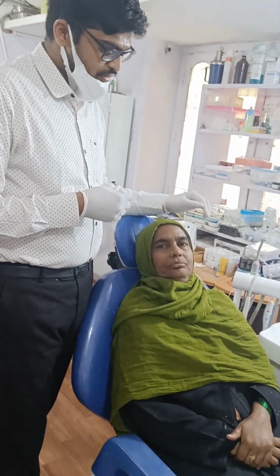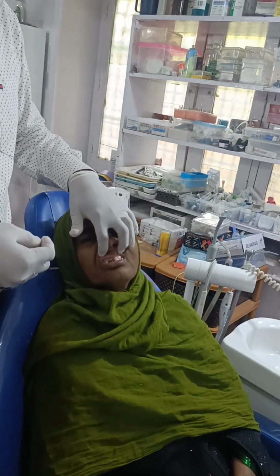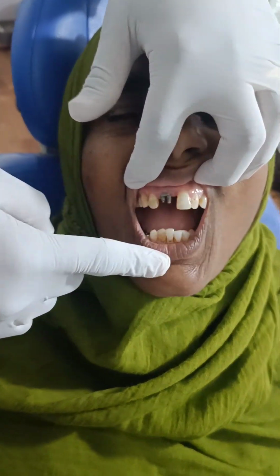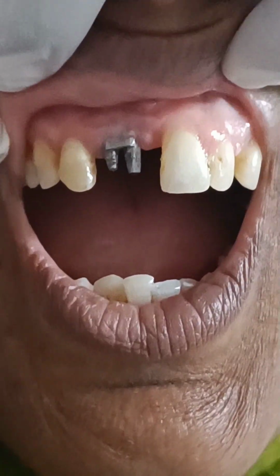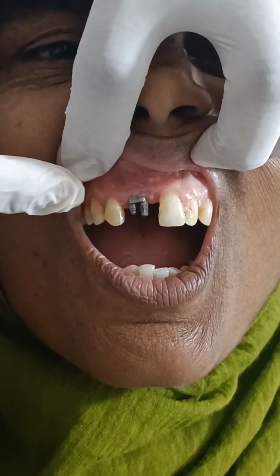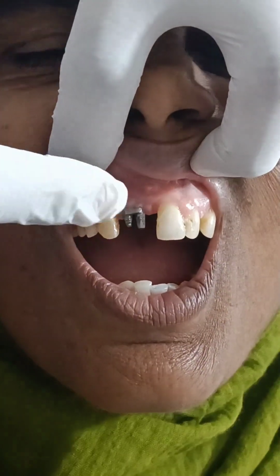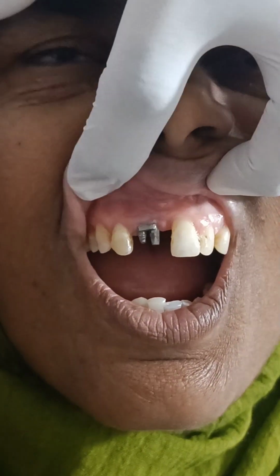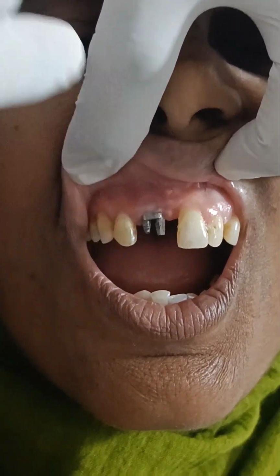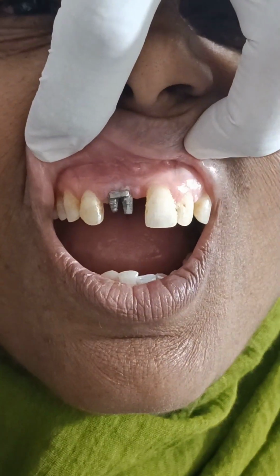I'll show you the condition of the patient. This is 3 days after the implant placement. There was a single tooth missing, the central incisor. It was periodontally compromised, and I'll show you the X-ray and a pre-operative photo also. We have placed 2 implants, and we bent and welded them, and this is the crown fabricated.